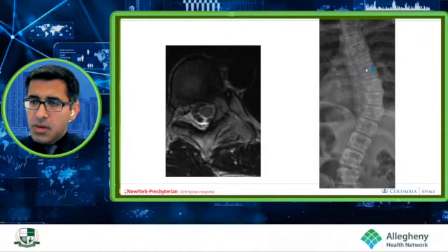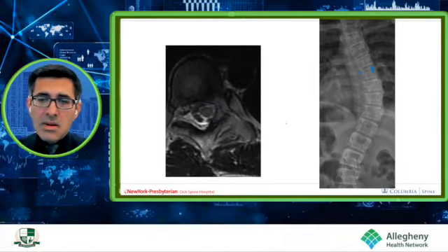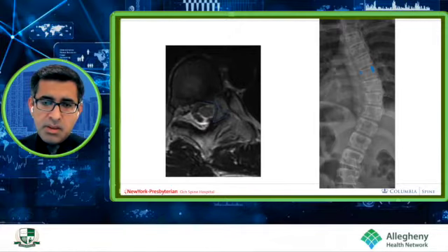Here, it shows the location of pedicles at the same segment, showing the difference in size. And then on the MRI scans, I will, again, look at the size of the pedicles, as you can see in this blue outline, which is a pedicle at the concavity, a small pedicle.